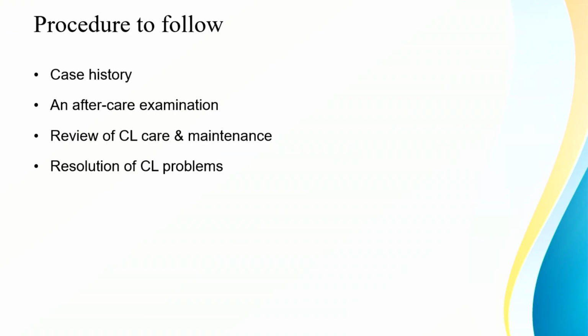So what will we do in a follow-up care? First we start with the case history. We ask the patient what lens are they wearing? Are they aware what lenses they are wearing? What is the modality? How frequently do they change it? Are they doing the care and maintenance correctly? Any difficulty in the handling techniques? And then we also go into aspects of vision. How is the vision? How is the fit?